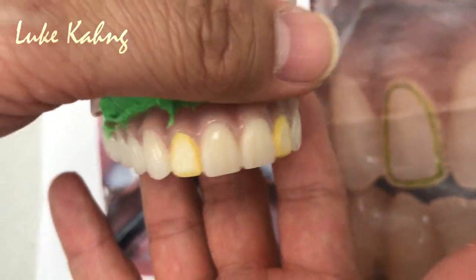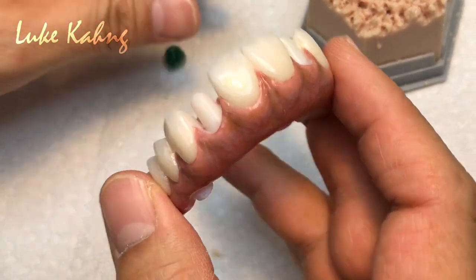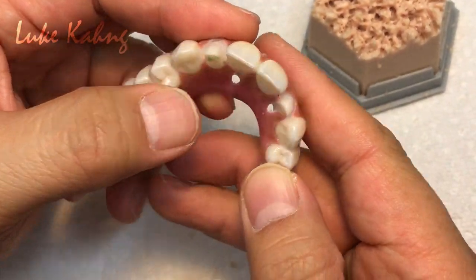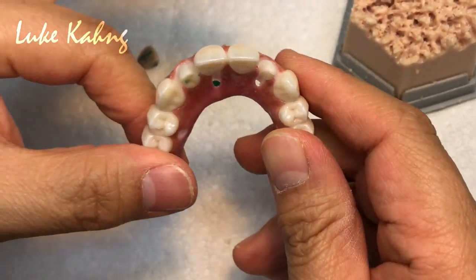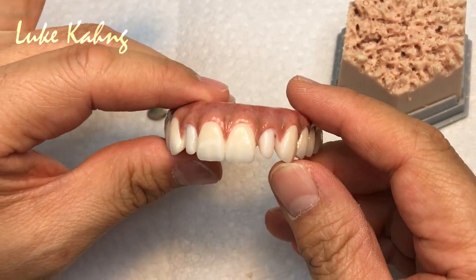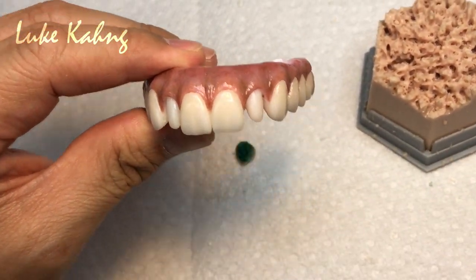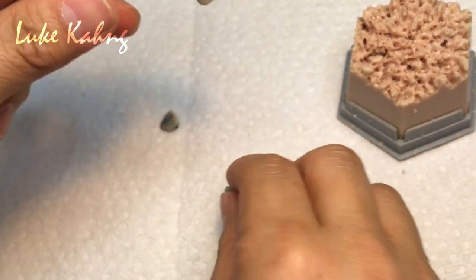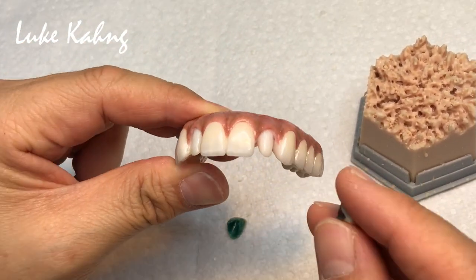Another unique case coming up. Good. Stage, which is the pretty tough cases, which I like. Full monolithic, we finish it. Of course, we prep the teeth. Well, remember, the patient wants the gold surrounded by, so we made the design in the wax.